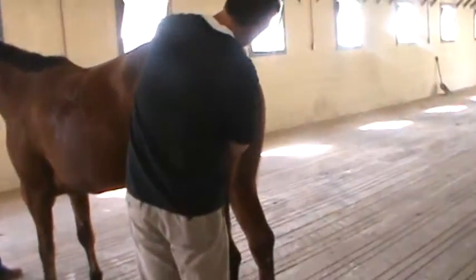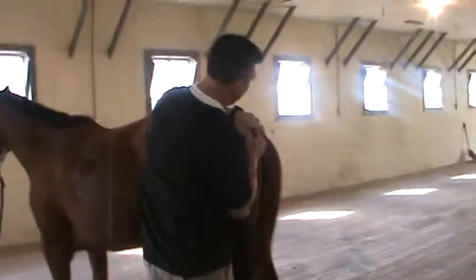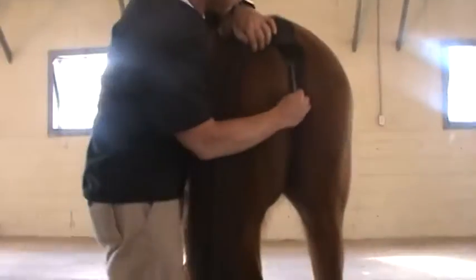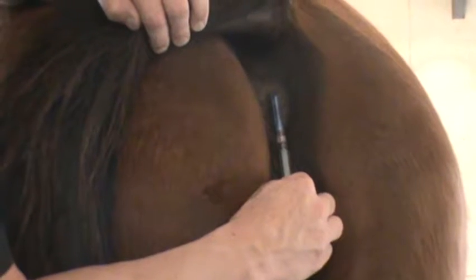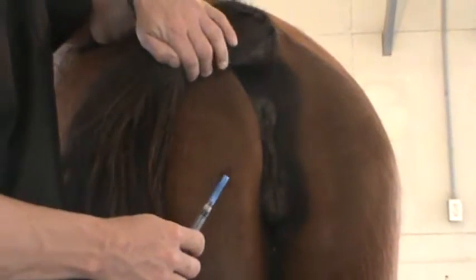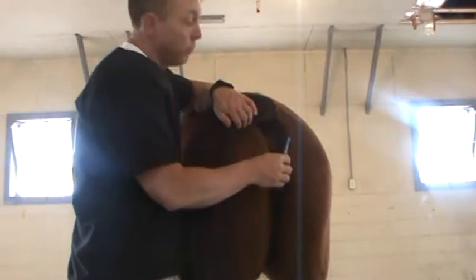So this mare has a really good vulva conformation. If we just draw a vertical line, we use the syringe here, and I touch the tips of her vulva, then you may not be able to see, but there's only a small recess, a small amount of space that goes back between the syringe and where her rectum starts. When we get concerned is if I drew an angle, if you want to go back to geometry, that'll give you nightmares tonight, won't it? If you drew an angle from perpendicular here, once it gets past 30 degrees, that's when we start getting concerned that the rectum is too far forward.